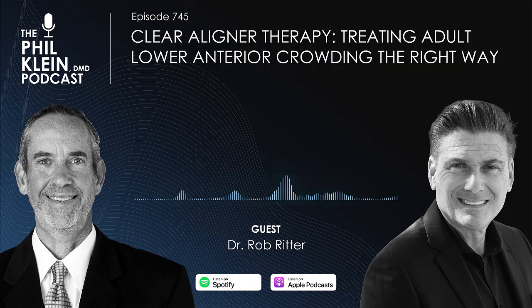Now, that's not to say things also won't need to be tweaked at the end of the aligner therapy. I've noticed that as well. Sometimes teeth don't move as quickly as we think they do. Every human is a little different. Their body reacts differently. So don't think that where you're starting and where you're ending is always going to be the end point. You might need to tweak along the way.